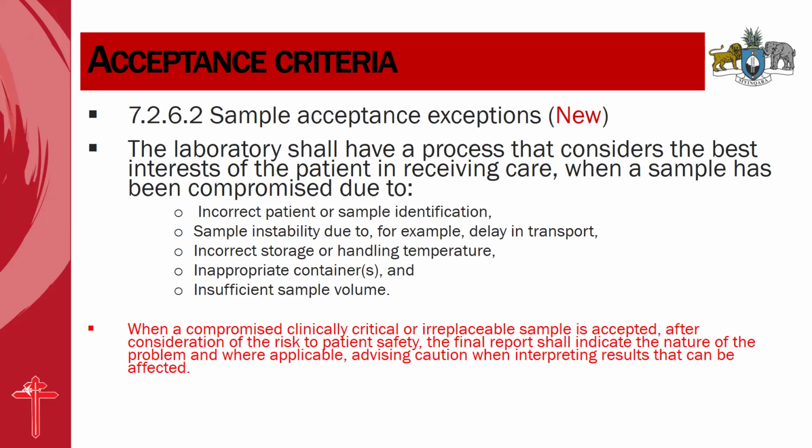continue processing the sputum. But while continuing to process the sputum test, you have to, as a lab, take note of any of the compromise that may have happened, like the ones I've stated there, so that in case there is any compromise in the results, you can easily track to see that there was a problem initially.